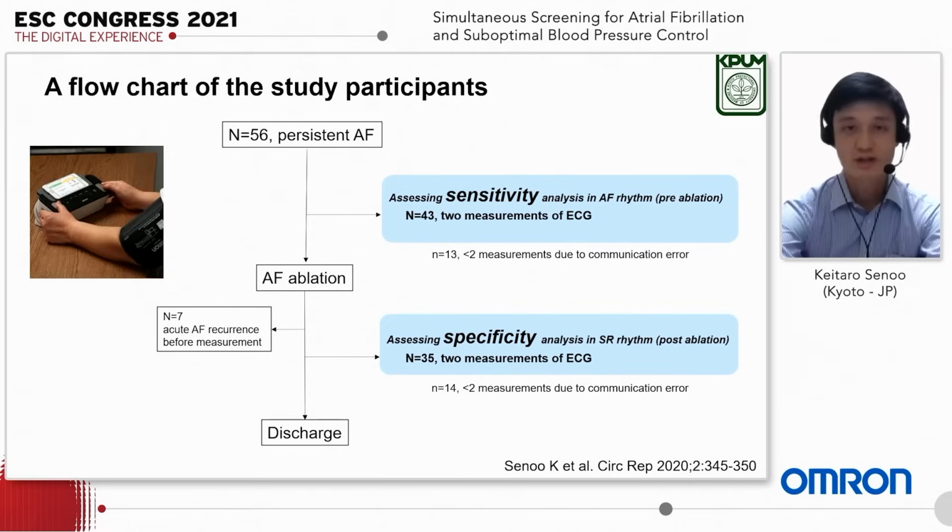Patients were instructed to perform two blood pressure measurements and 30-second EKG recordings of a bipolar lead 1 rhythm strip by touching the electrodes located on the top face and both sides of the monitor. If a recording could not be interpreted as normal or possible atrial fibrillation, the patient was instructed to perform another measurement. Within 2 hours of the measurements with the complete devices, 12-lead EKG recordings were obtained. This series of processes was performed before and after ablation during the patients' hospitalizations.